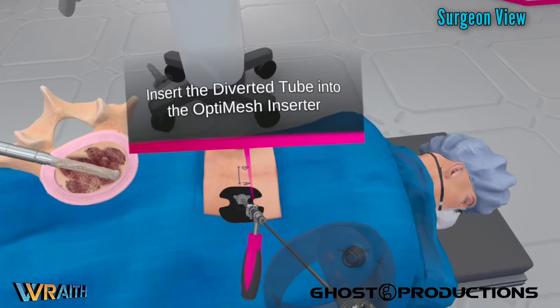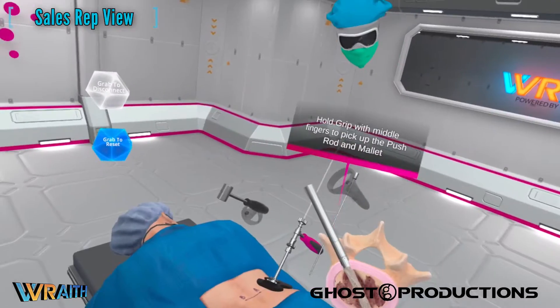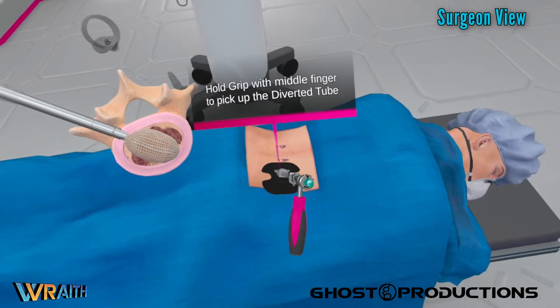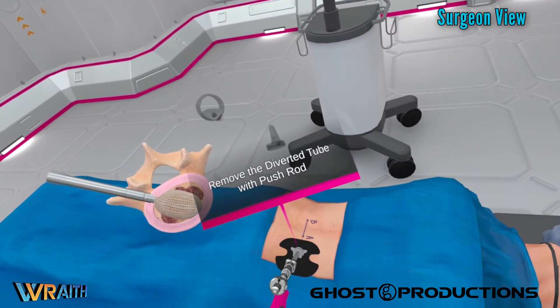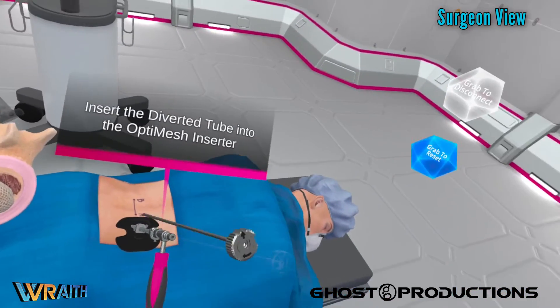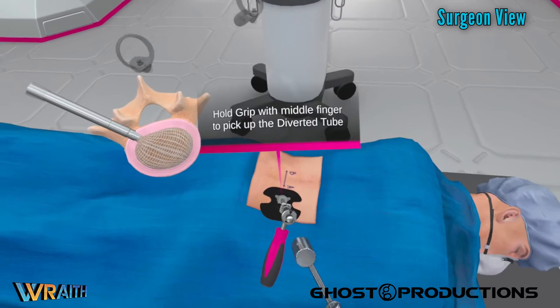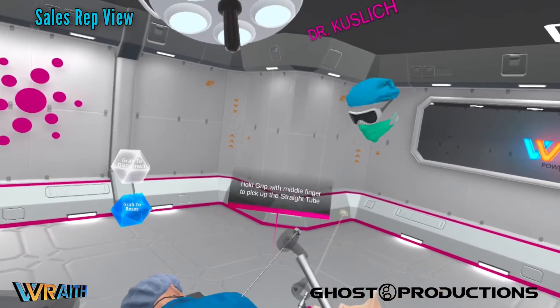I can spin this around to get all the different angles. That's correct. The way you do that is with this push rod and mallet to drive the bone graft — you really drive it in there. Three or four times on the bone tube; that's something you'll manually do. You can really decide which direction the graft goes. We'll take a series of bone tubes to completely fill the OptiMesh. You'll feel the impaction get to a point where you can't add more bone graft — that's how you know it's as filled as it can be with the diverted tube.